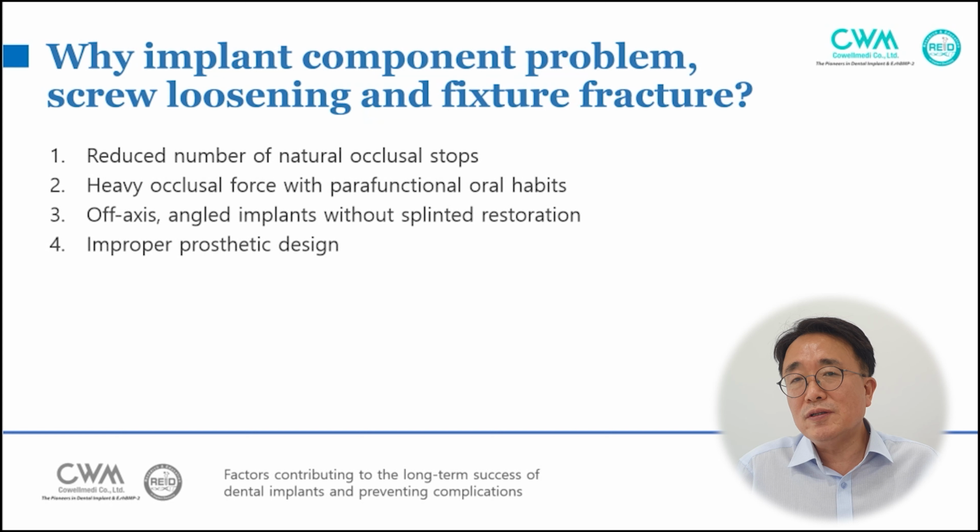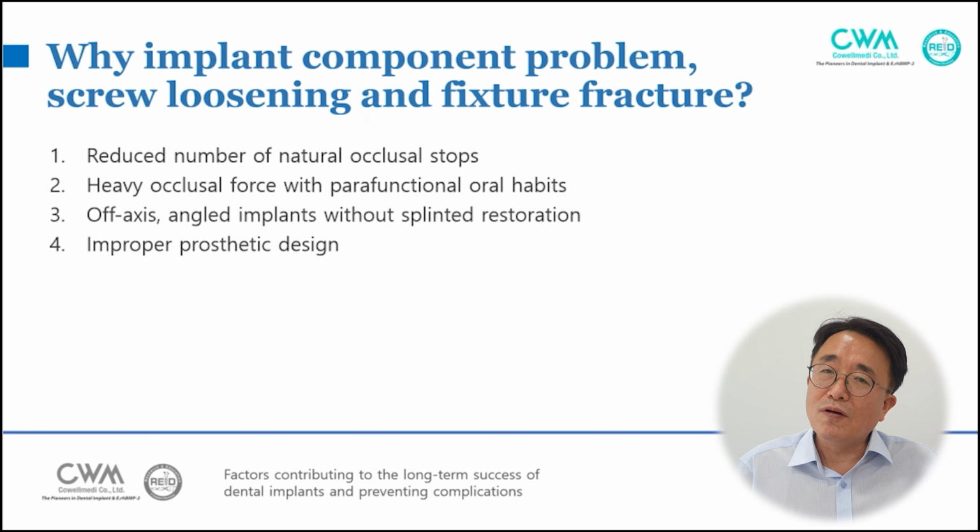And third, an off-axis angled implant without splinted restoration could induce component problems. And fourth, improper prosthetic design. Examples are lack of splinting or an excessive offset axis, cantilever.